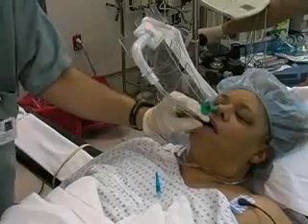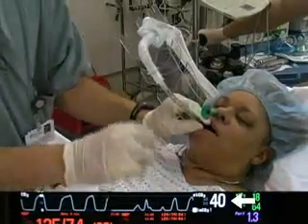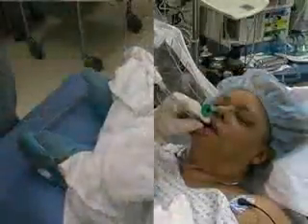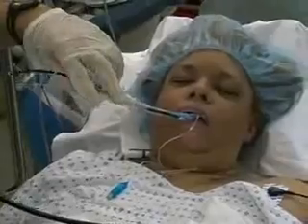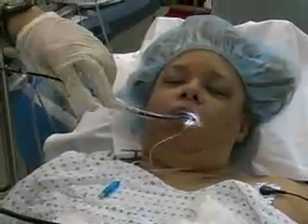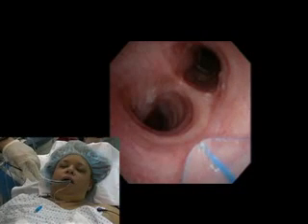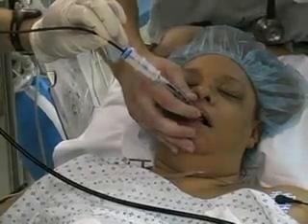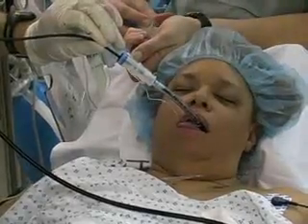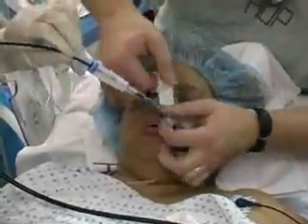Here, the patient continues to breathe spontaneously, as evidenced by the end tidal carbon dioxide. She follows commands to take a deep breath and can move her toes when asked. While the patient remains awake, use the fiber optic scope to confirm the location of the tube in the trachea. Visualize the tip of the endotracheal tube in the trachea and readjust its position until it sits 2 centimeters above the carina. With the endotracheal tube in the correct location, inflate the cuff with a clean syringe. After the endotracheal tube is correctly placed, the airway is protected and it is safe to anesthetize the patient.